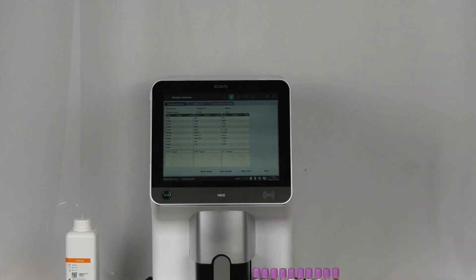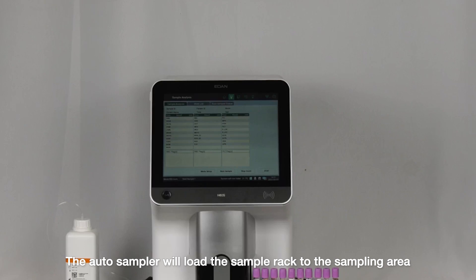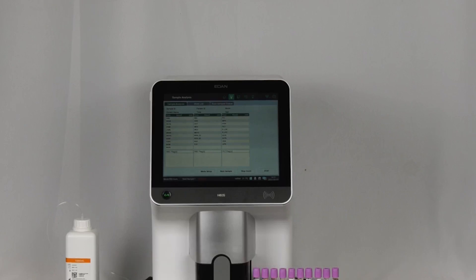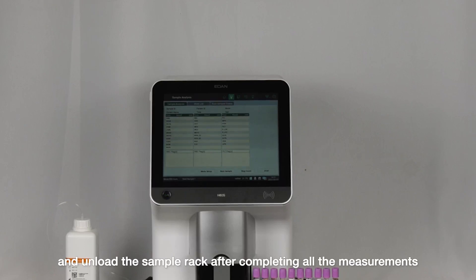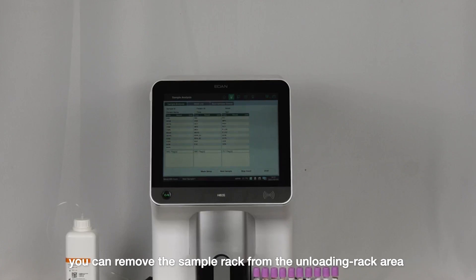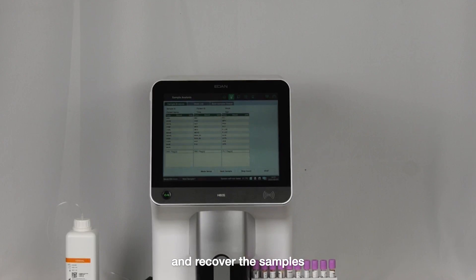Press start on the screen. The auto sampler will load the sample rack to the sampling area and unload the sample rack after completing all measurements. You can then remove the sample rack from the unloading rack area and recover the samples.